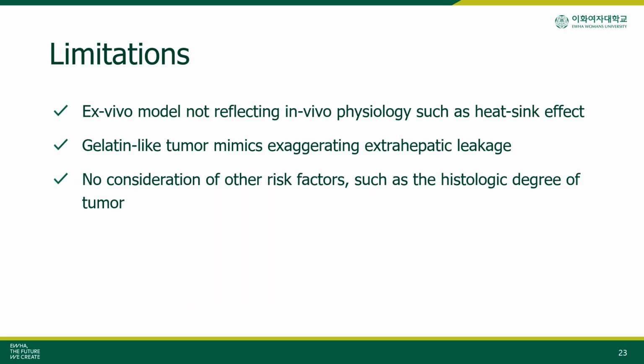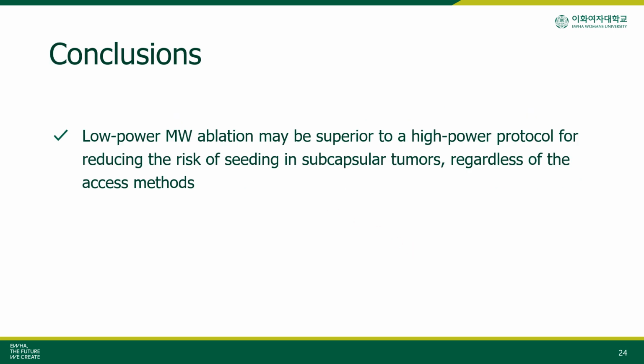This study had several limitations. First, the study was confined to an ex vivo setting, therefore it cannot represent in vivo physiology. Second, the gelatin-like tumor mimic models used in the study dissolved into liquid at high temperature during ablation, making them more susceptible to leakage than in their solid state. Finally, this study did not account for additional factors influencing the risk of tumor seeding.